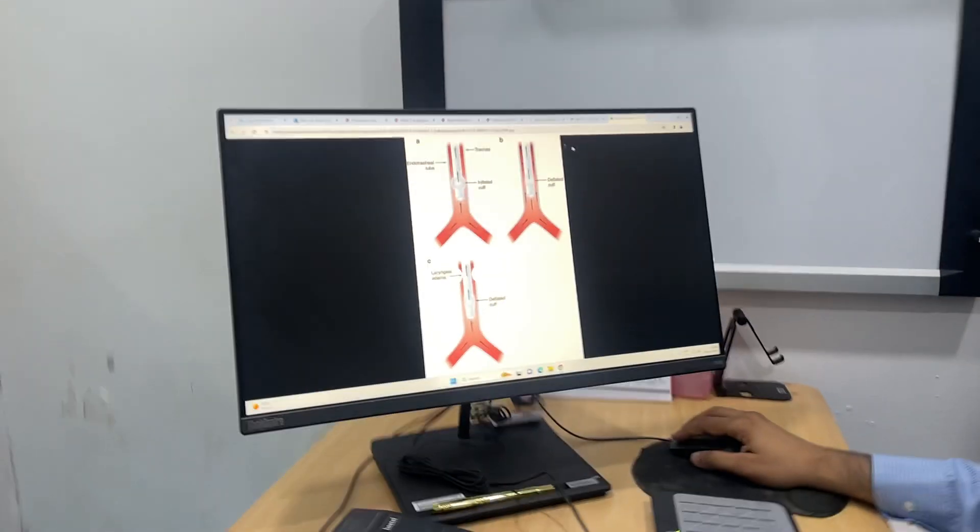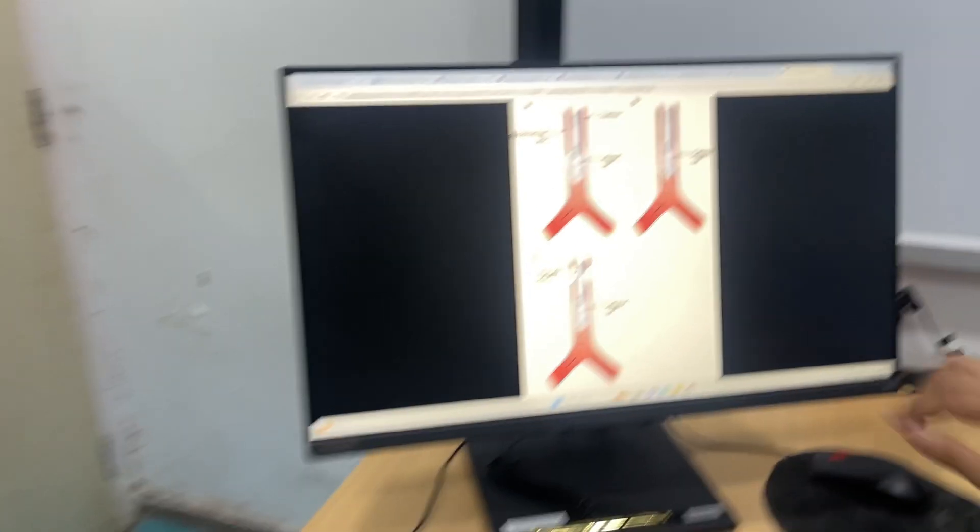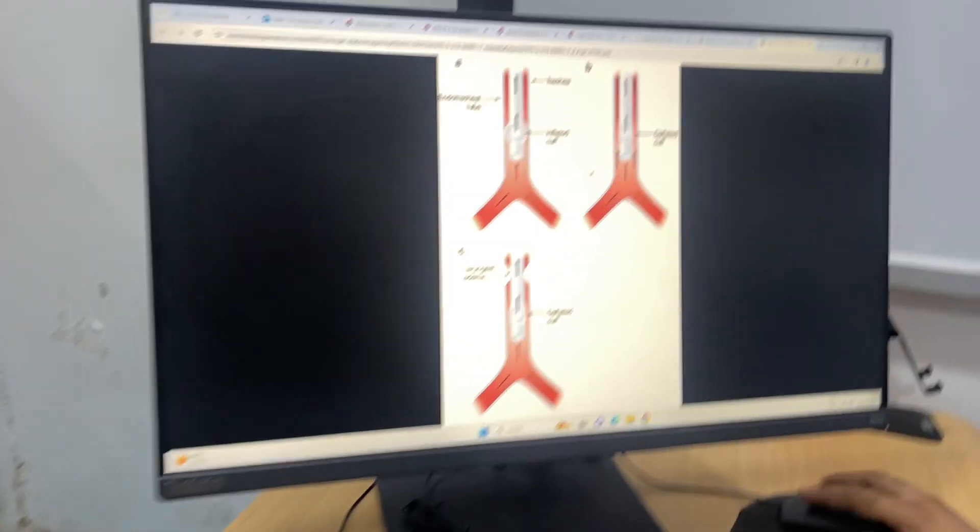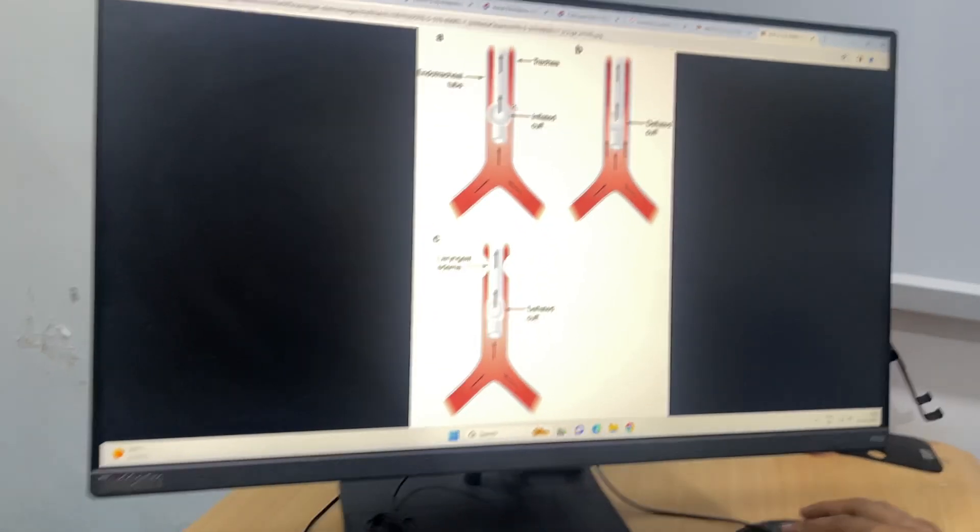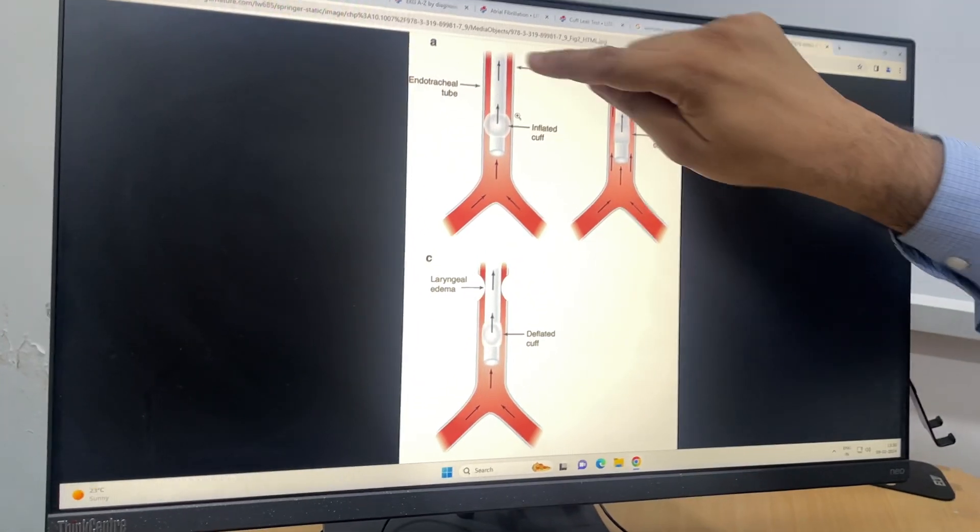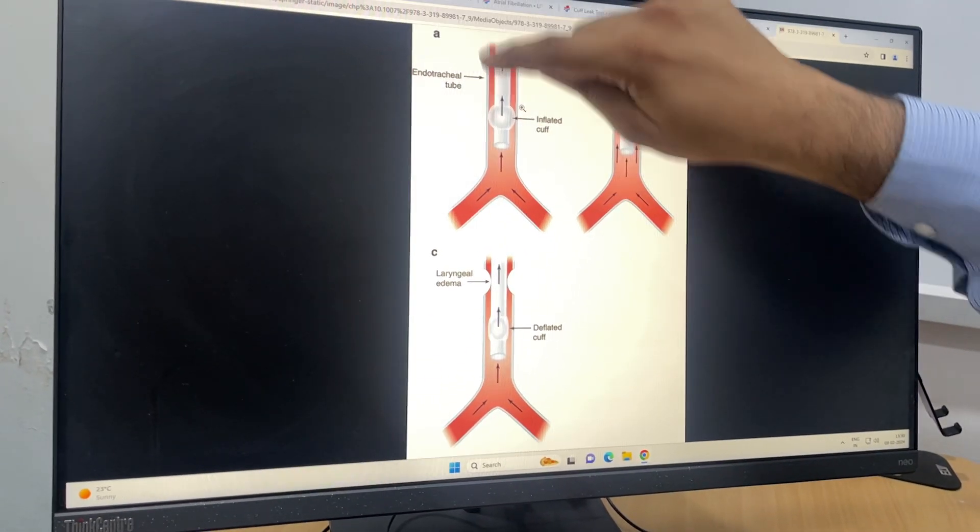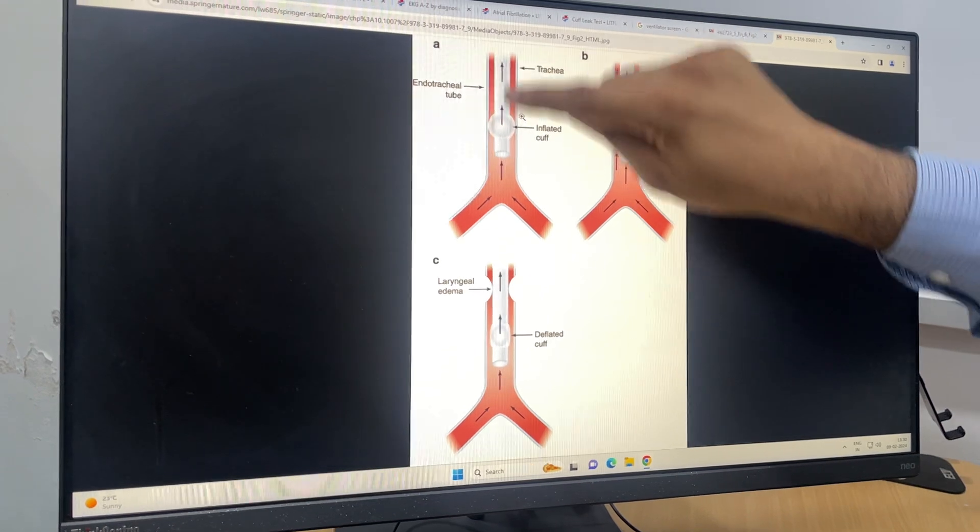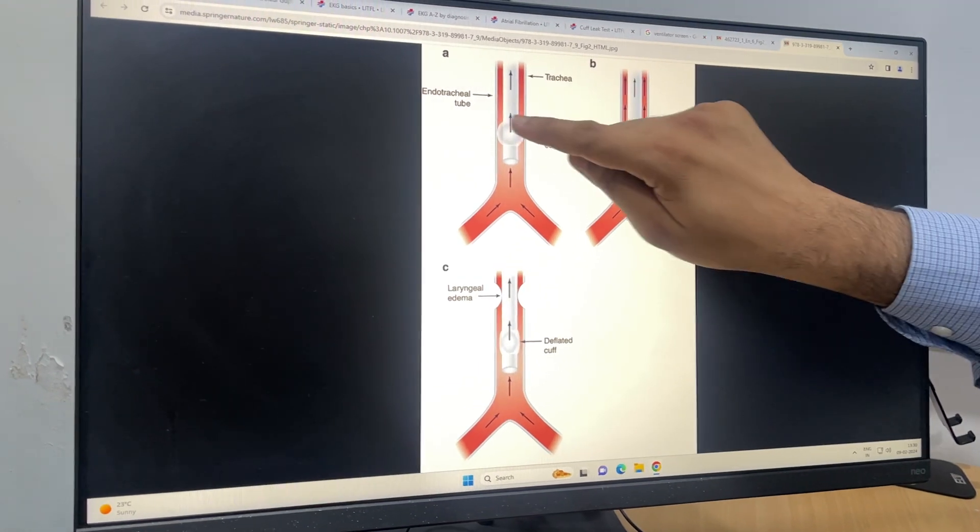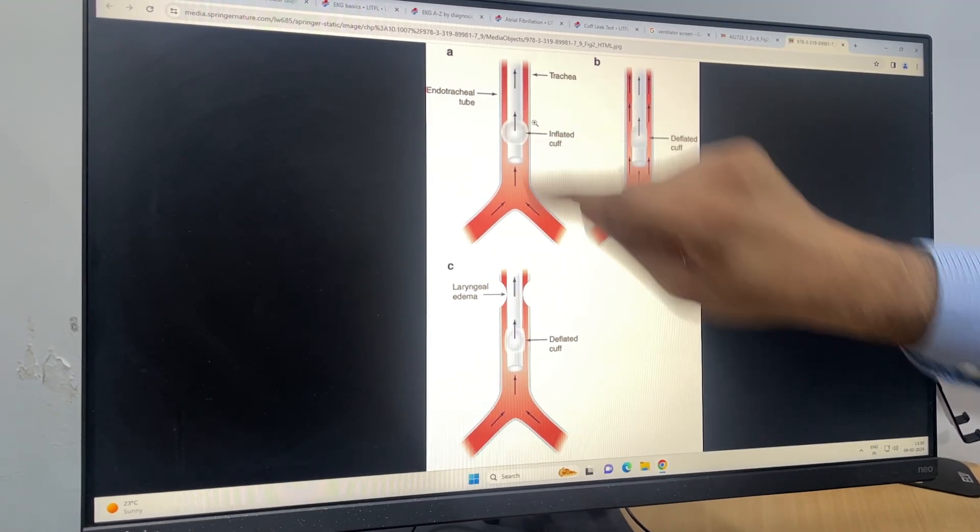So what happens in this cuff leak test? Normally we have an endotracheal or tracheostomy tube, and the cuff is inflated around the endotracheal tube so it seals the tracheal wall. Let's see—Dr. Prerna, can you come here? You see here, this is your trachea, this is the endotracheal tube, and the cuff is inflated.